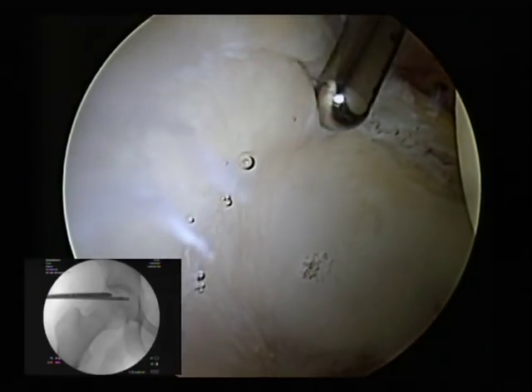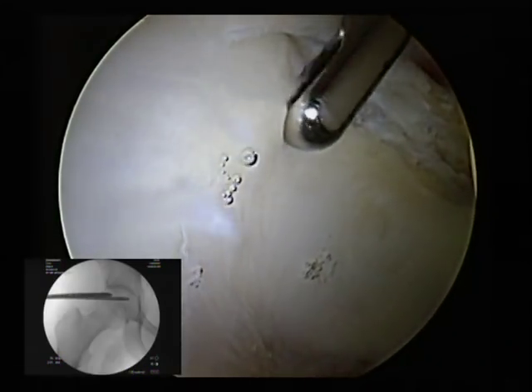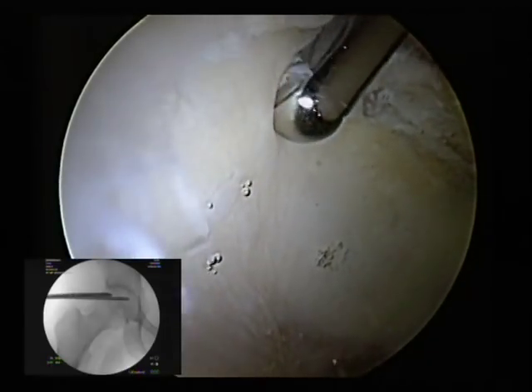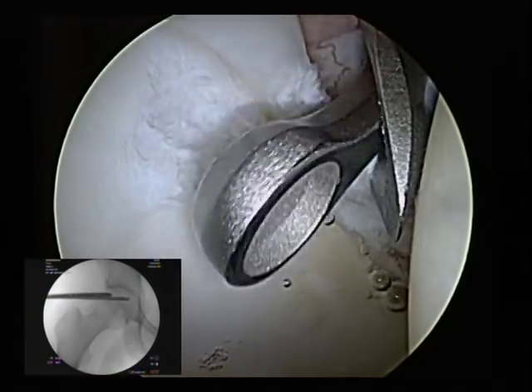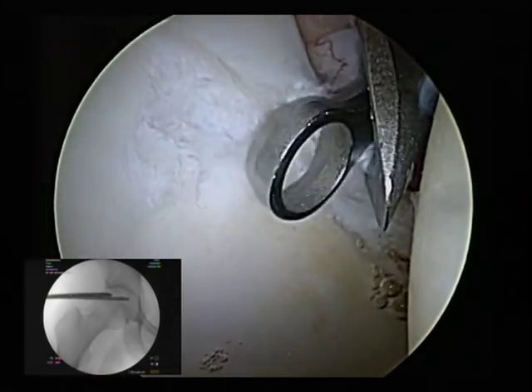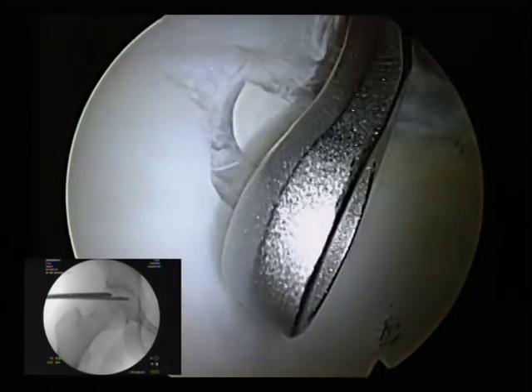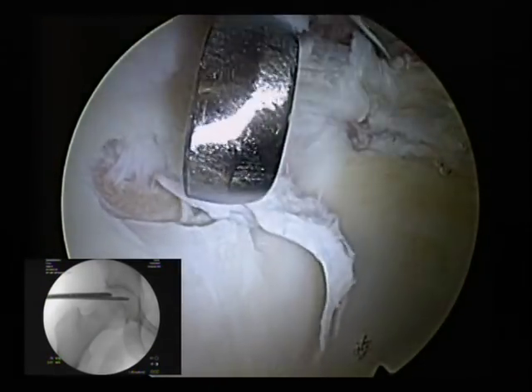A lot of times on these patients, what I tend to do is a little bit of a chondroplasty. So we'll start our debridement here of the chondral delamination. We're going to take the ring curette and take a little bit of this chondral delamination. What we try to do is delineate the normal articular margin here. This looks like it's starting to get pretty normal, very solid, up to about there.